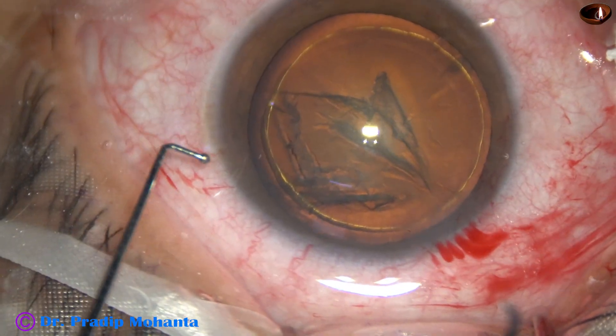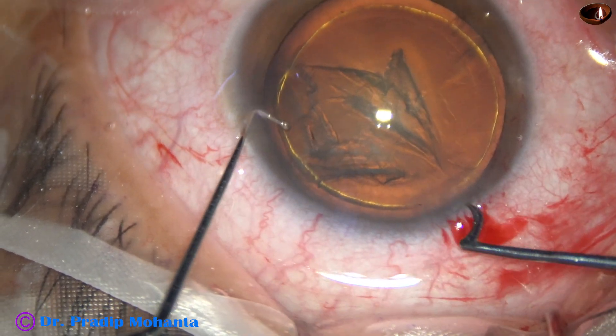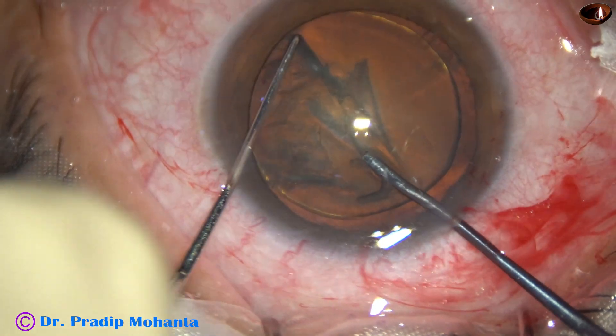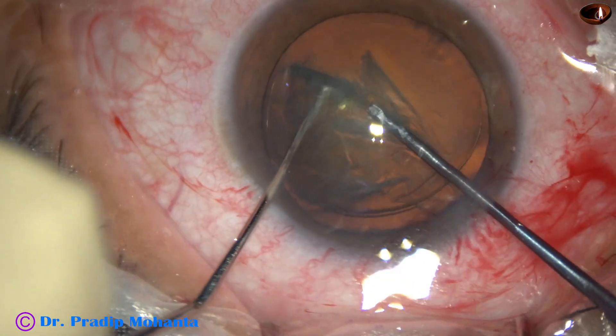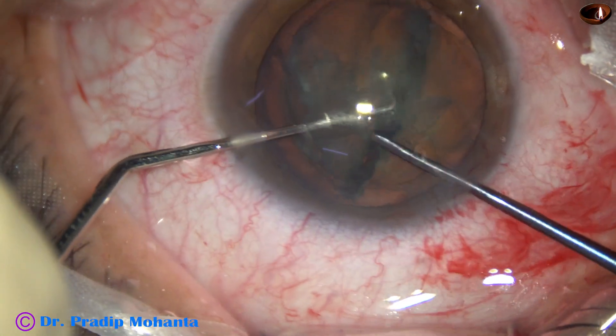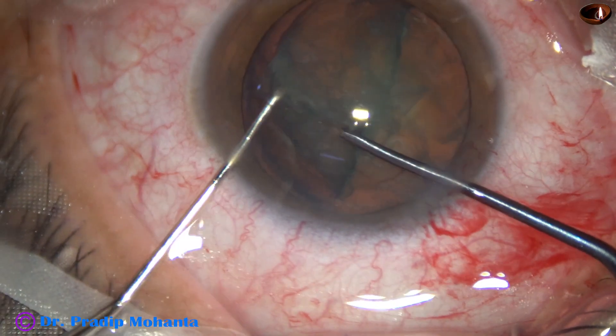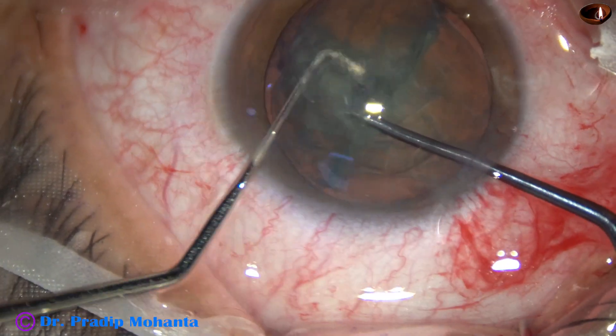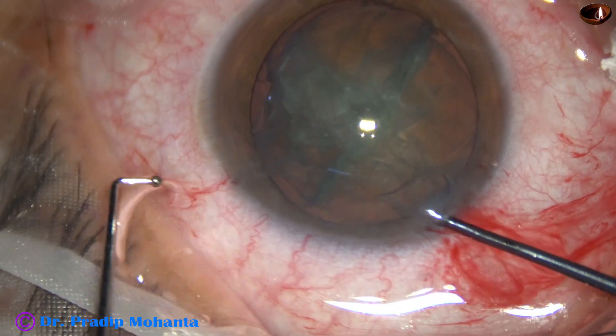Now is the time to divide the nucleus. I am using the pre-chopper designed by Dr. Sohail Irfan Khan to divide the nucleus into two hemi-nuclei, and then one hemi-nucleus is divided into two pieces. And then I come out.